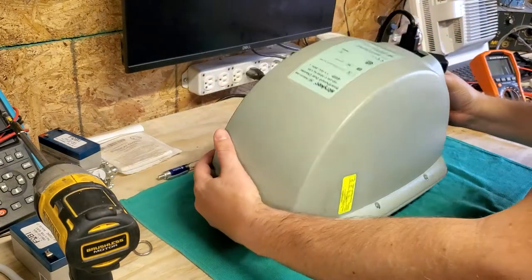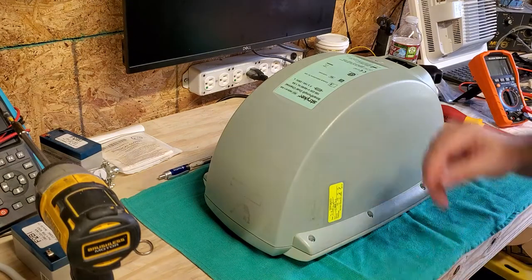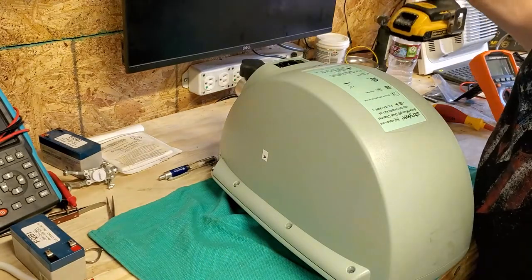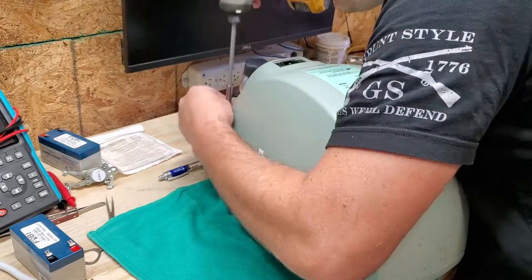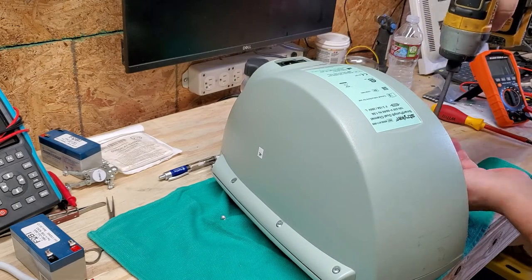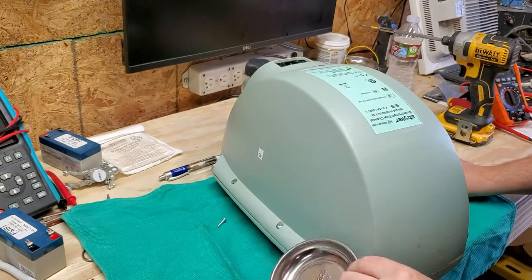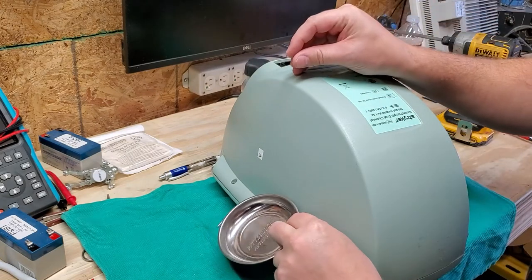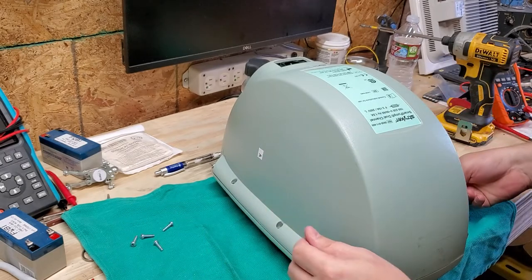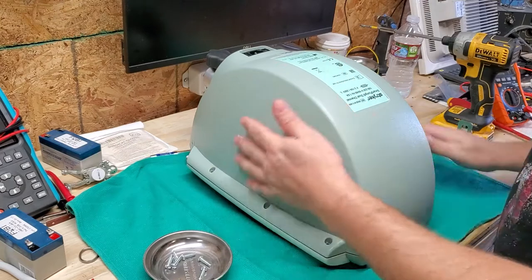The battery life expectancy on this should probably be around three years since it is a tourniquet. Let's go ahead and open it up. There are some perimeter screws around the outside and then two at the bottom. Let's zip these off real quick. I'm using a magnet to pull out my screws — luckily these screws are magnetic because a lot of stainless steel fasteners are not.